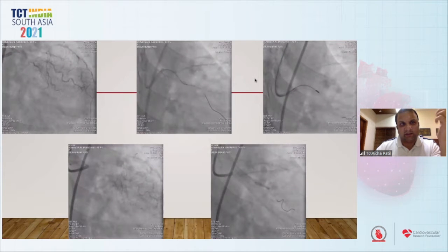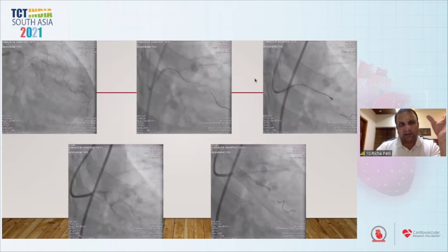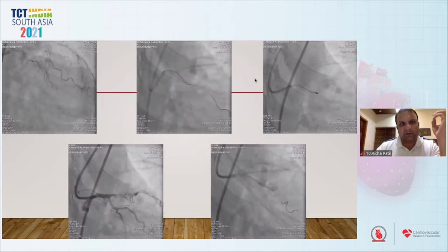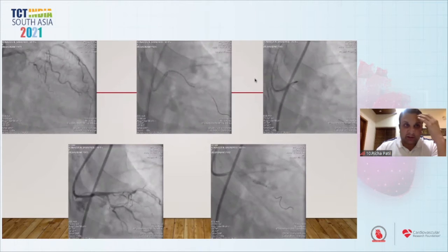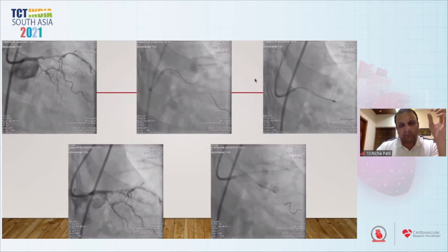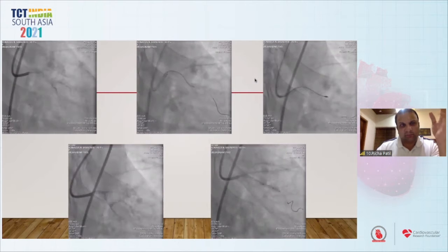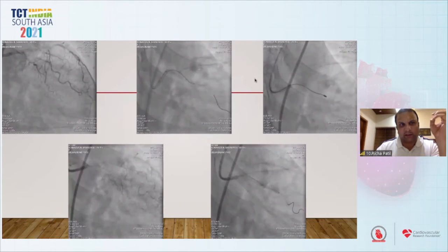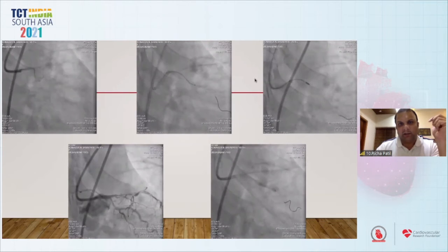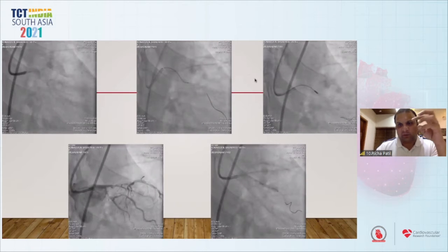As you can see, she was a 48-year-old lady with severely calcified coronary, small vessels. The patient was not at all ready for a CABG. There was no other way but to go ahead and do stenting. I saw the lesion at LAD and circumflex. First, we thought we'd go and dilate the work on the circumflex. There were acute angles both at the LAD ostia as well as the OM. Tried to cross with a balloon and then stent, couldn't cross. So thought of doing a Rota.